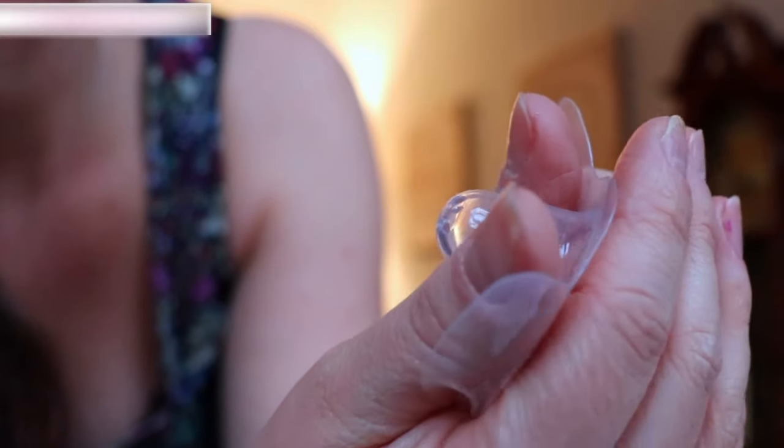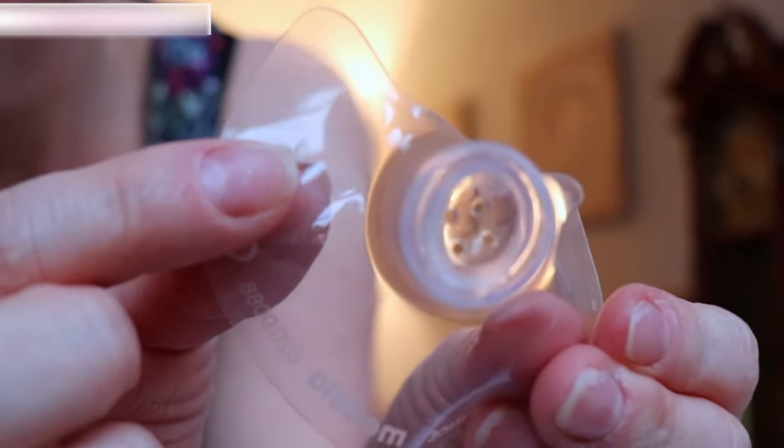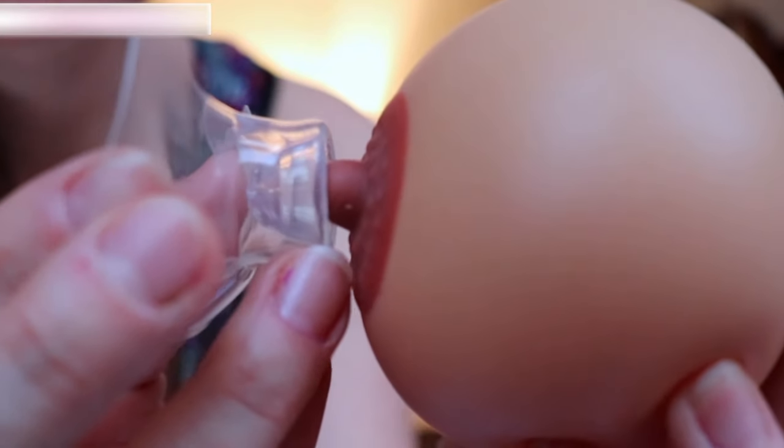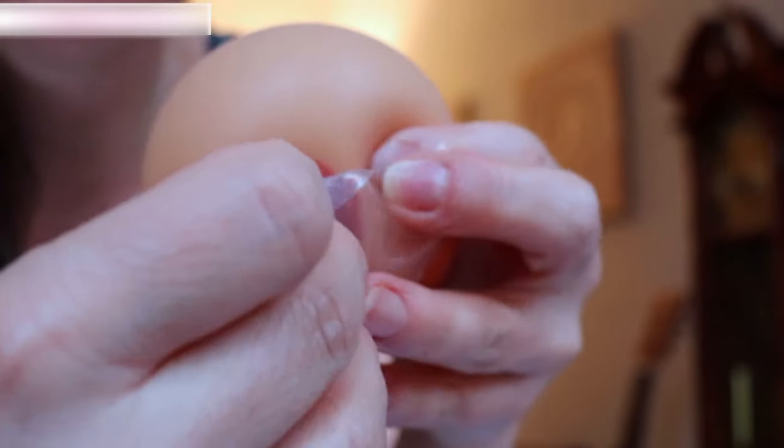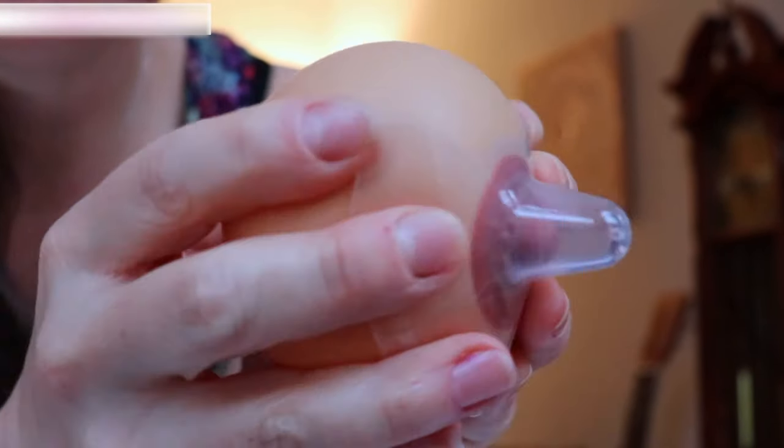In the case of a shorter nipple or an inverted nipple, the idea is for the nipple to be pulled up into this little cone area. We achieve that by putting our thumbs on the base of the nipple and flipping it halfway inside out, so it leaves a little dimple in the end. Then we place the nipple into this dimple and stretch the base of the shield over the breast, and it should pop the nipple right up into it.